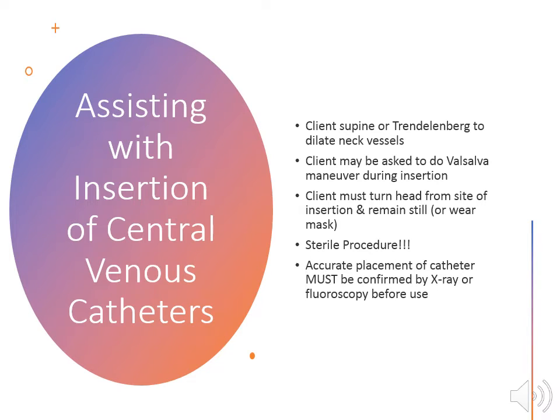You must turn the client's head away from the site of insertion and have them remain still or wear a mask. Why would you do this? It increases the visualization of the site for the person inserting the central venous catheter. It also maximizes the accuracy of placement of the catheter and ensures surgical aseptic technique, because the patient's not breathing on it or moving. It is a sterile procedure.